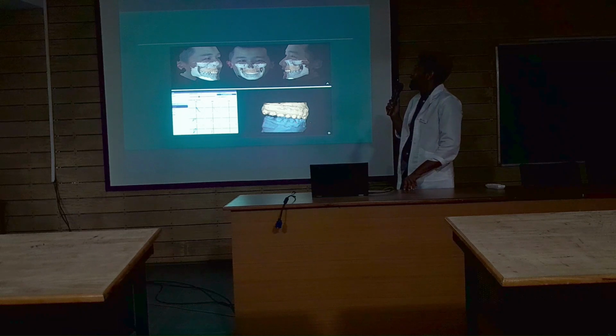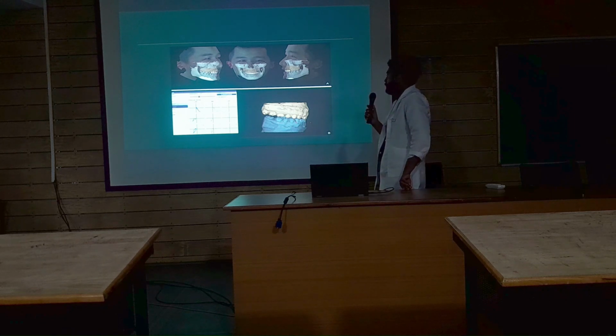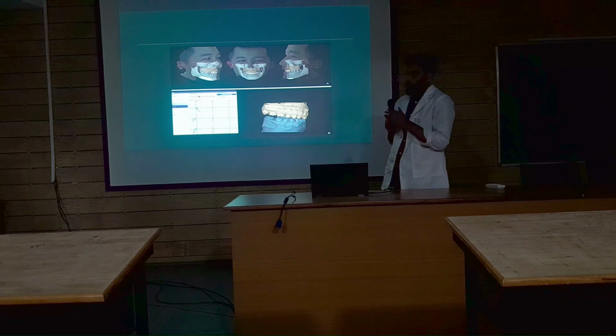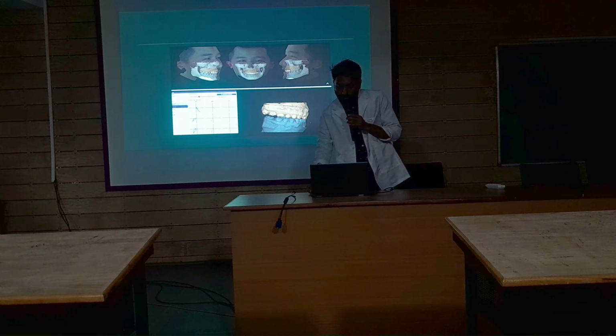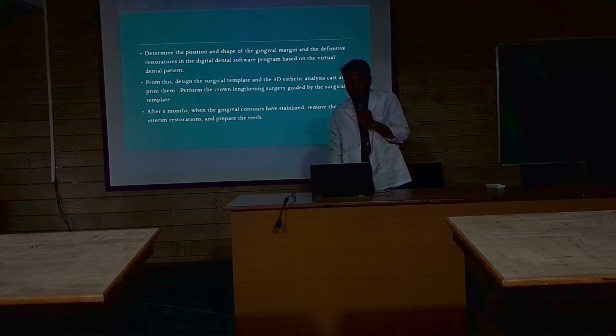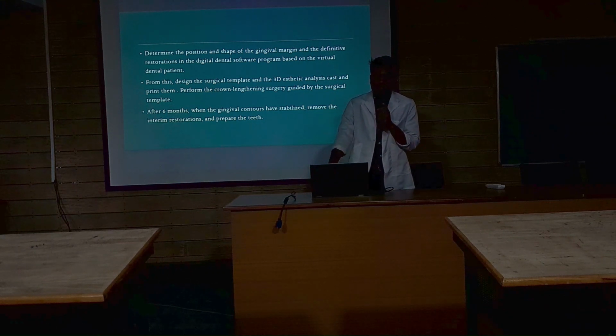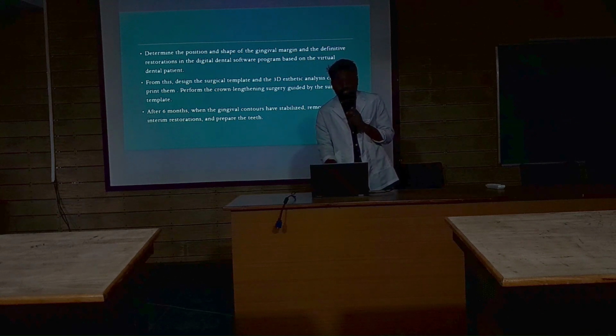We can see that by merging all the data we had from intraoral scanning, extraoral scanning, and CT, and we also got the mandibular movement. It's a still photograph. Now we determine the position, and we know that the patient had to undergo a crown lengthening surgery. So we determine the position and shape of the gingival margin and the definitive restoration in the digital dental software program based on the virtual dental patient.